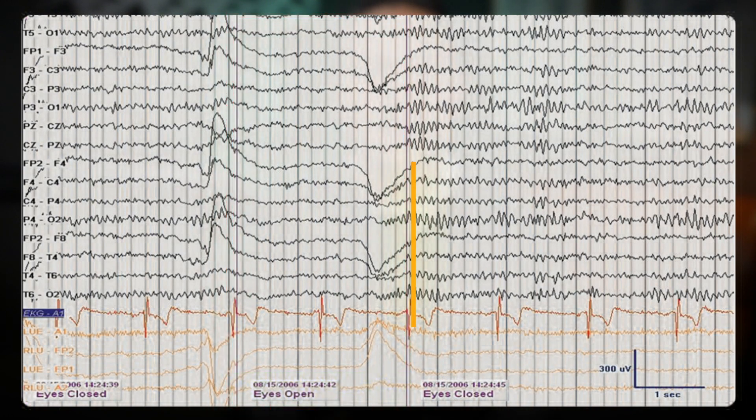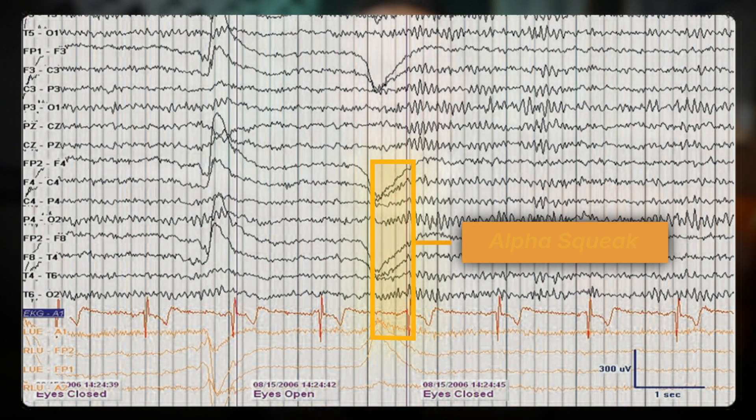Notice the briefly faster frequency immediately following eye closure, often termed the alpha squeak.